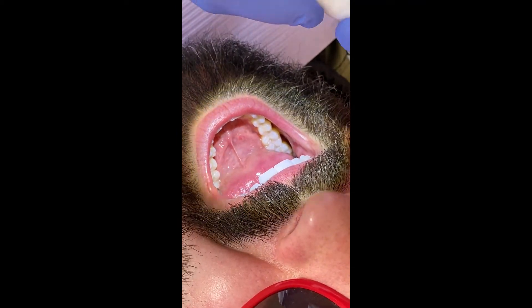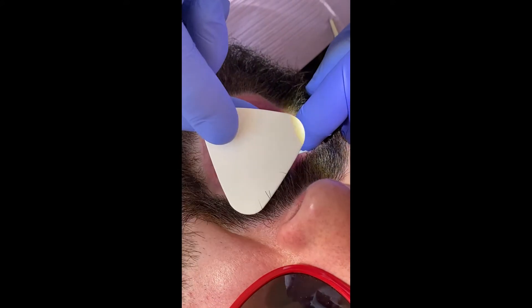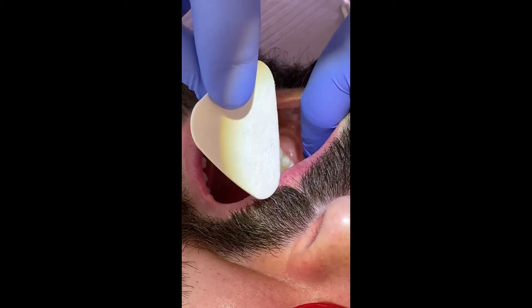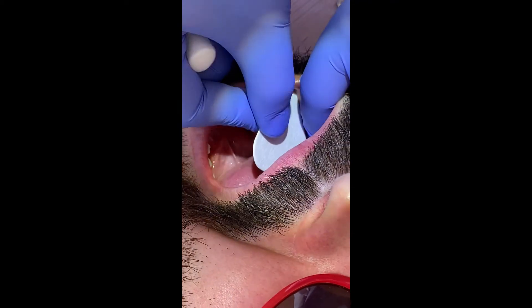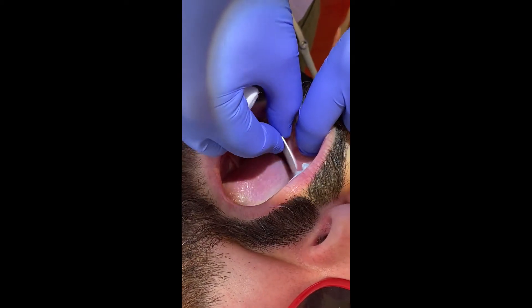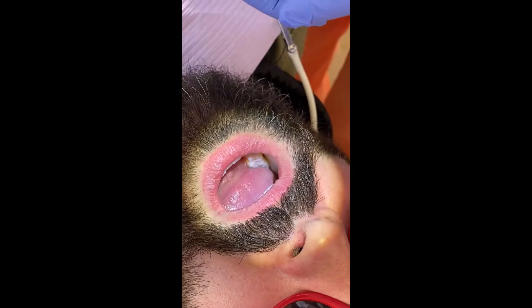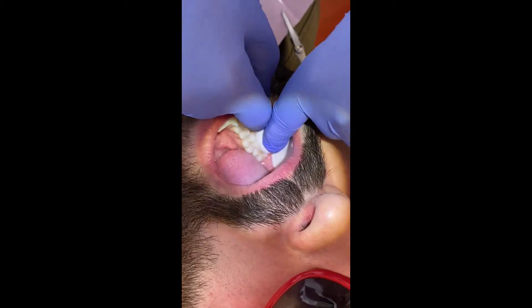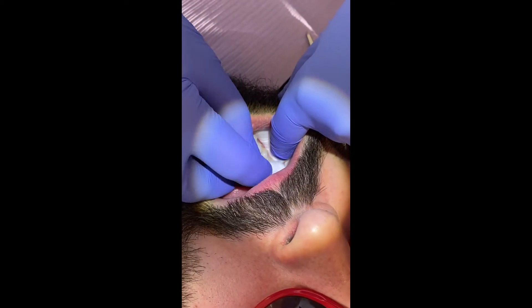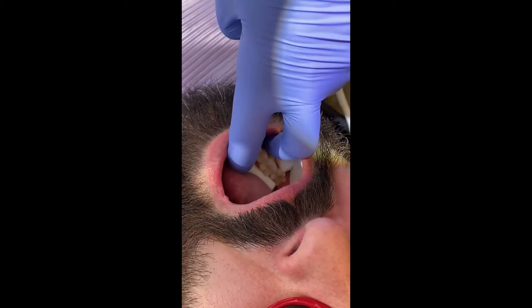Now that we've etched the patient's tooth, we're going to isolate one more time. I like to use a combination of a dry angle and cotton rolls. You take the dry angle, insert it at an angle — you're going to want to take that pointy part and put it towards the back of the patient's throat. You're going to want to wrap it around the maxillary buckles of the patient and give it a little squeeze in place. Then I'm going to place a cotton roll, and then one more cotton roll. Beautiful isolation.